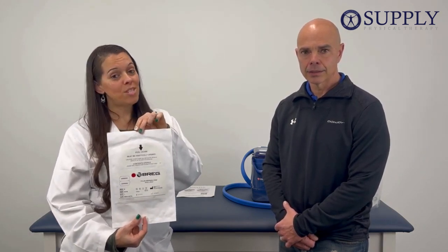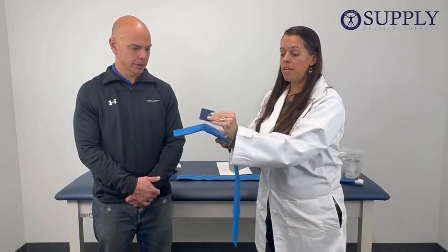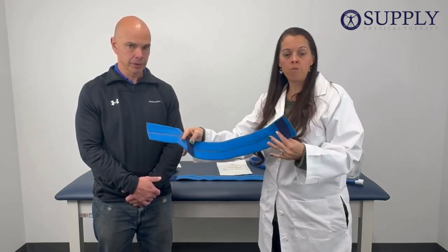Now that we've made sure we have the correct hip pad for our system, we're ready to apply it. The hip pad is going to come with two straps. These velcro pieces can be removed and adjusted, and that way it helps you fit the strap on a little bit better depending on your body type.